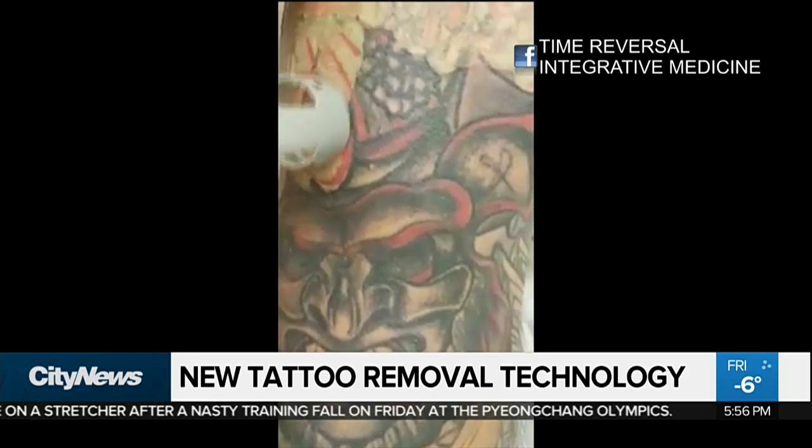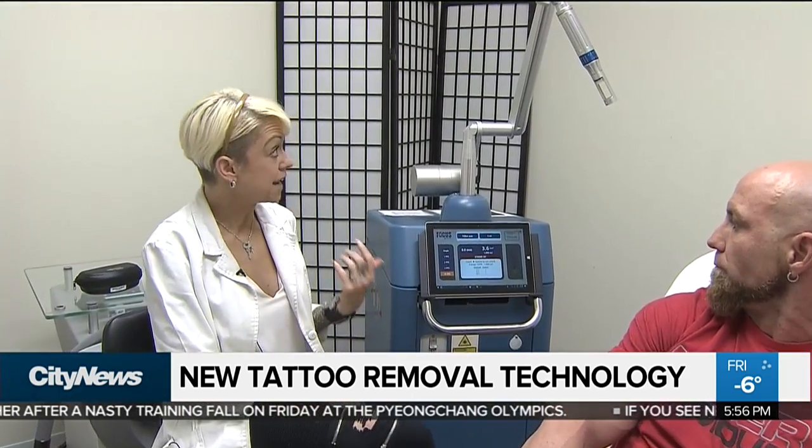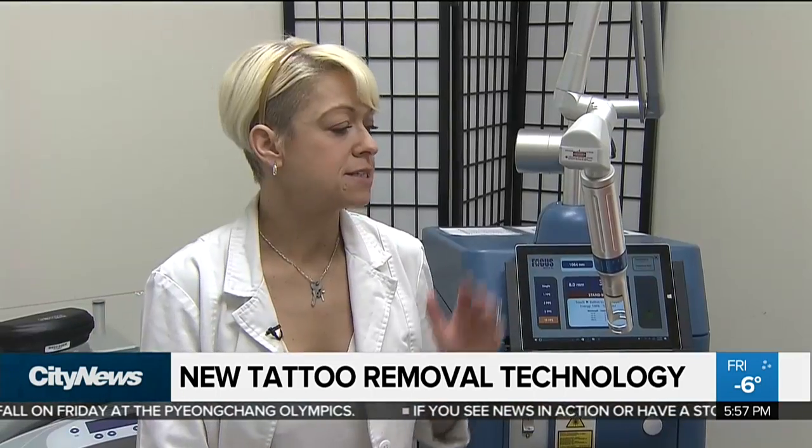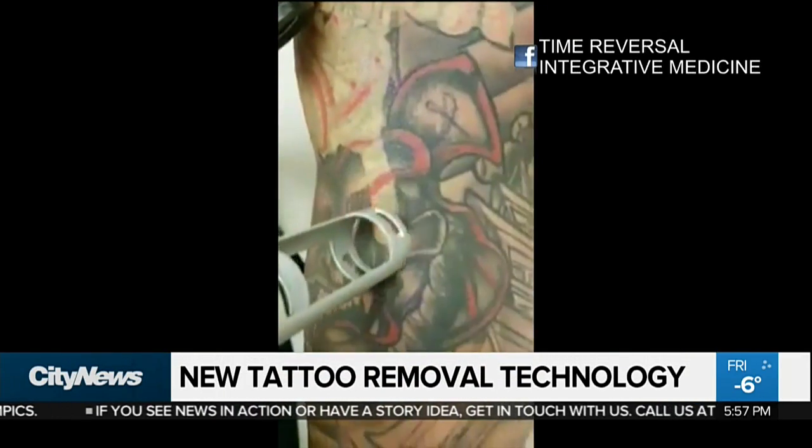So this is the Pico 4. We were the first ones in Canada to get it. You touch the skin for the patient and the laser beam comes through here. It has nano settings and Pico settings — nano meaning larger particles being broken up and Pico being smaller particles being broken up.